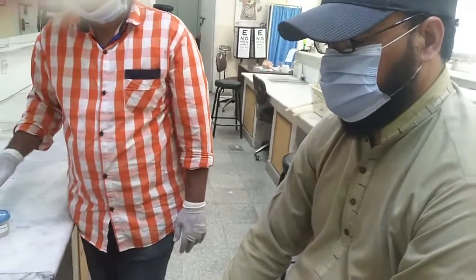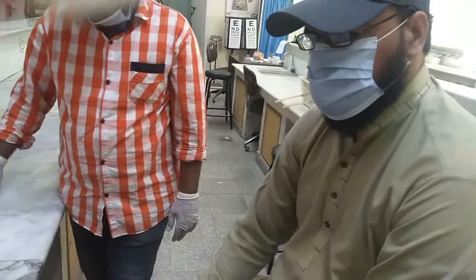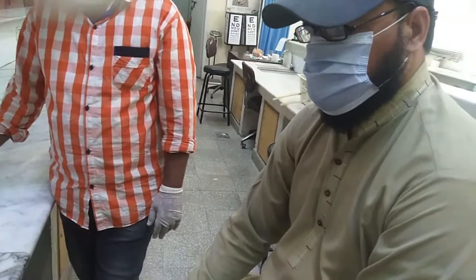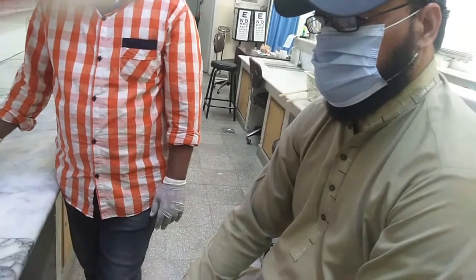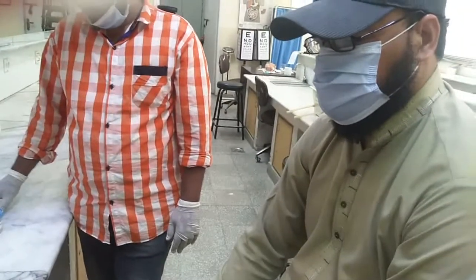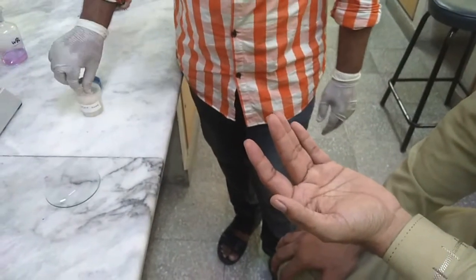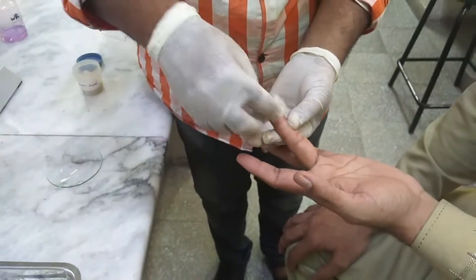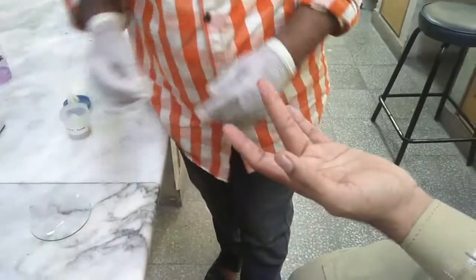After introducing herself as Dr. Ikra and explaining that a small finger prick will be performed to collect a blood sample, consent is obtained from the subject. Now we will take the sample. Any finger of the subject's hand will be cleaned with the help of a spirit swab, then it will be let to dry for a couple of minutes.